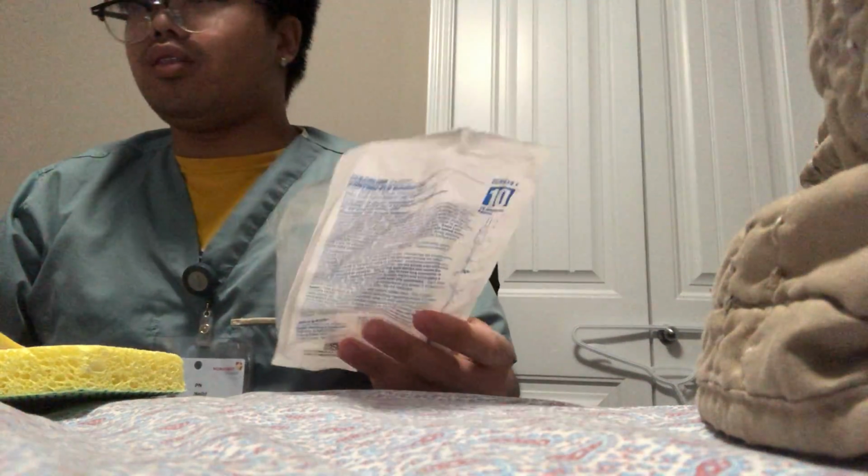So the doctor's order is 50 milliliters, and here we have 10 drops per milliliter. So what to do is 50 milliliters divided by 6. So we got 8 drops per minute, but I'm gonna count 2 drops for 15 seconds.